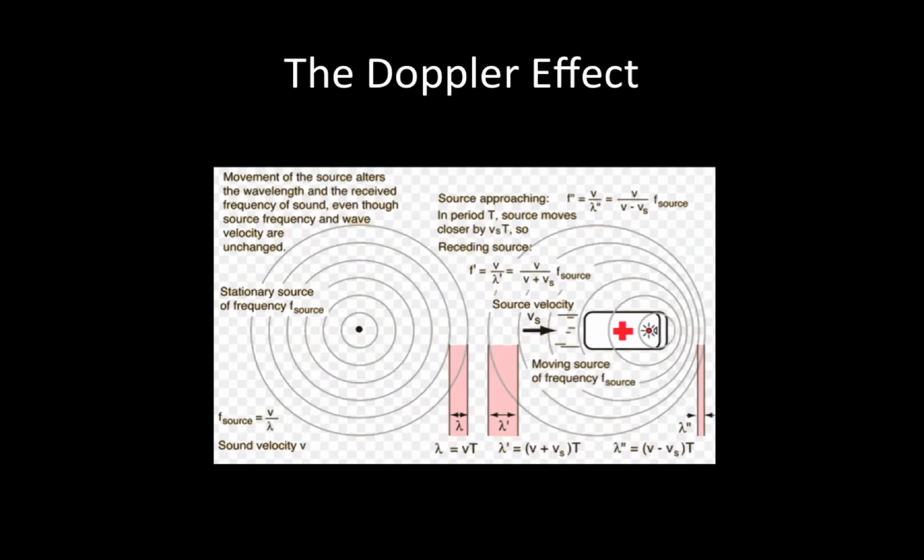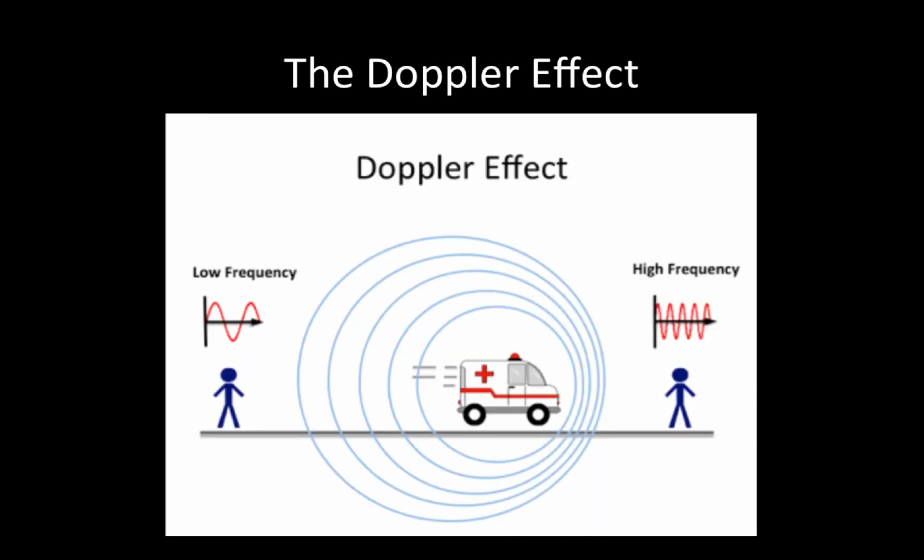So the Doppler principle. This is probably familiar to most people from high school physics. However, like most things from high school physics, it's probably buried pretty deep under years of medical training. The classic example that you might remember is that of an ambulance siren changing in tone as it drives past you, and this is because of the changing frequency of the sound waves relative to you, a stationary observer.